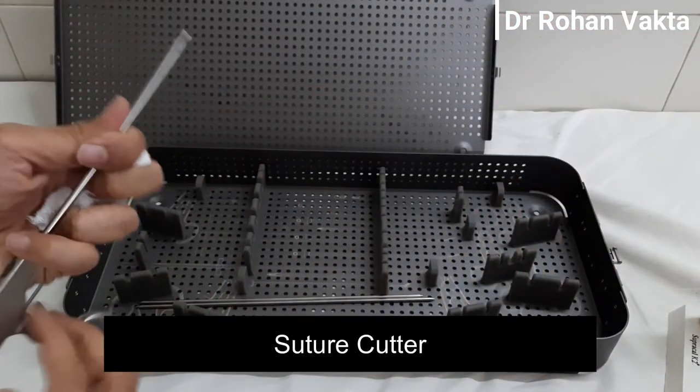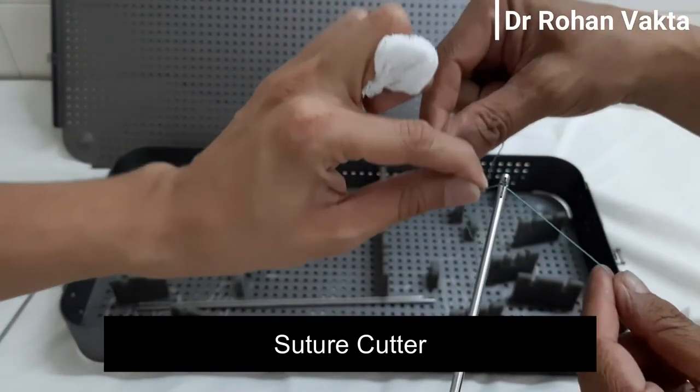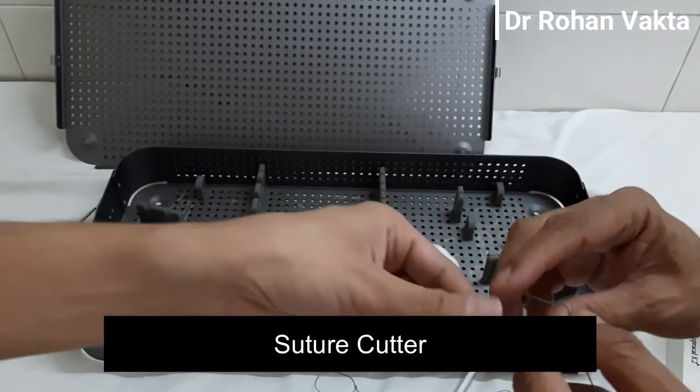This is known as the suture cutter or fiber wire cutter. Fiber wire is very strong and requires a very sharp cutter to cut the suture ends without fraying.